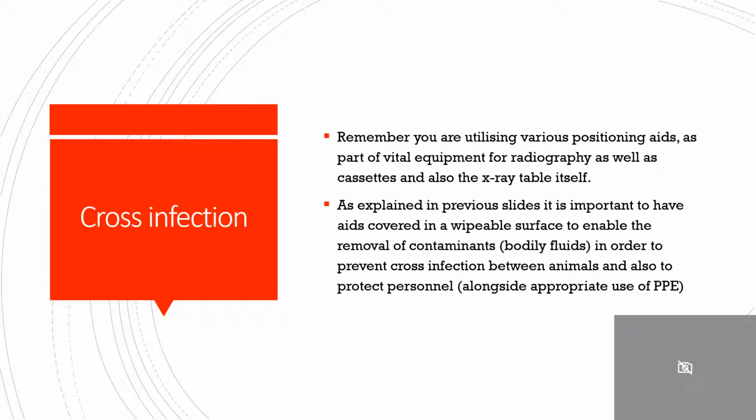Cross-infection. Remember that you are utilising various positioning aids as well as parts of vital equipment for radiography, as well as cassettes and also the X-ray table itself. As explained in previous slides, it's important to have aids covered in a wipeable surface to enable the removal of contaminants such as bodily fluids in order to prevent cross-infection between animals and also to protect personnel alongside the appropriate use of PPE.